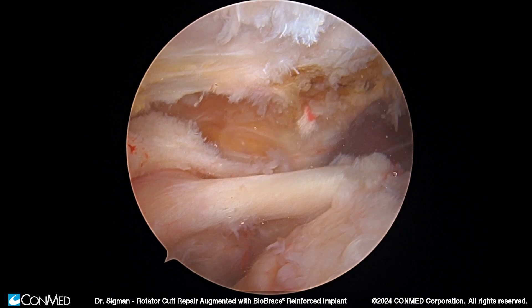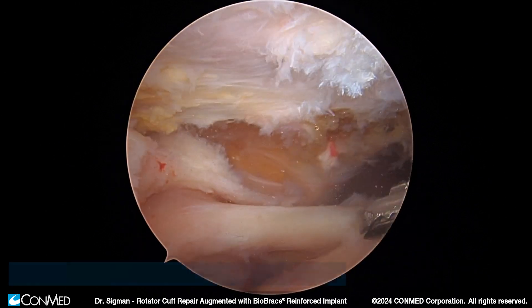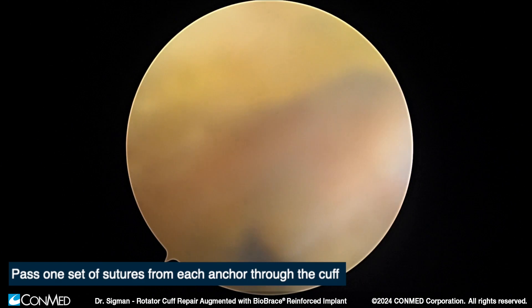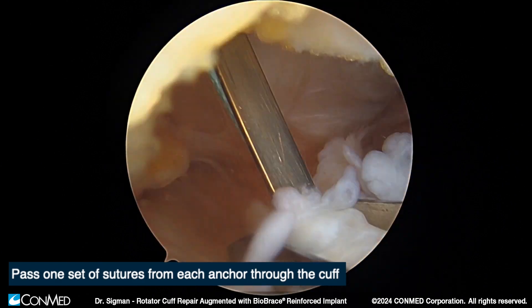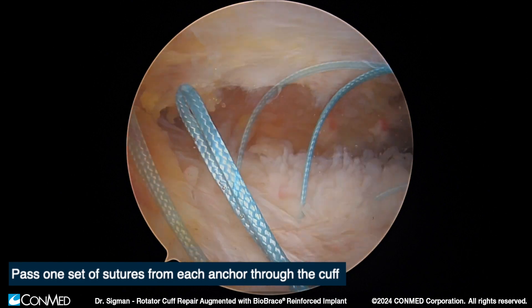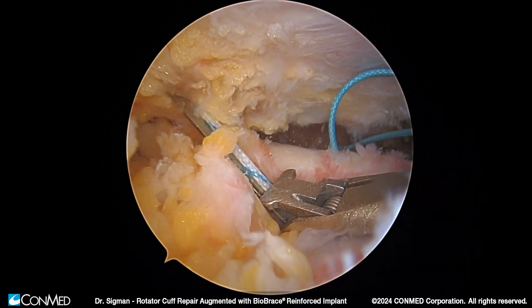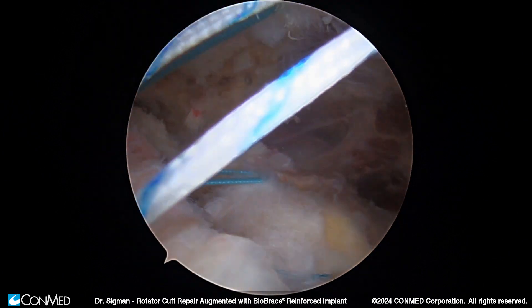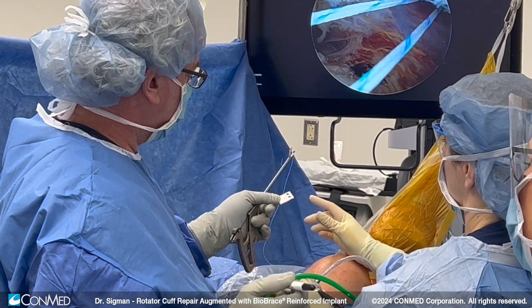Here you can see we're going to use a standard suture passing technique. We've mobilized our rotator cuff down to the footprint. We're going to pass two sutures in a horizontal mattress fashion, anterior and medial to the supraspinatus. Then as we move back to the infraspinatus interval, we're going to pass the posterior sutures up and through the medial aspect of the rotator cuff as well.